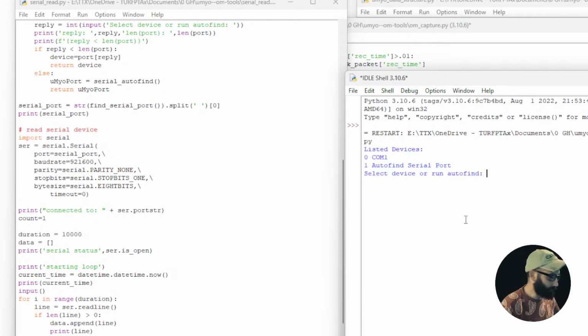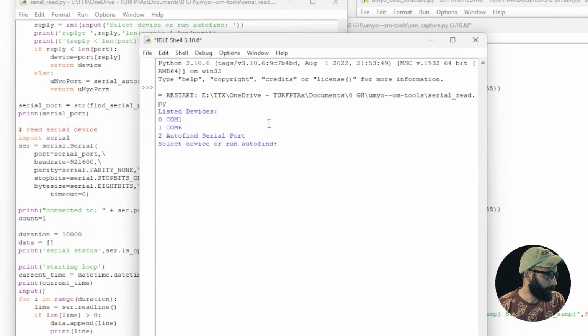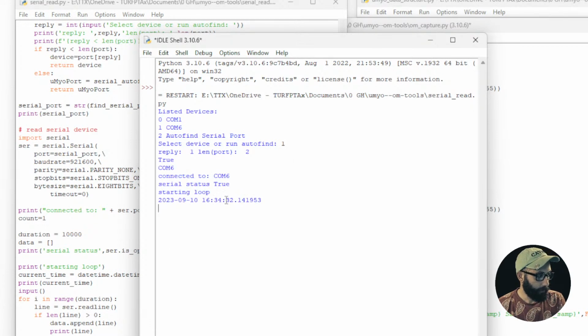I think it's because when I have all the different camera angles together that my computer wants to crash, so I'm going to avoid using that scene. I'm going to turn on one of the devices. I'll have to close this shell. Okay, and I want to run it. So now it's working. So it is in COM6, so we can do 1. And so it should tell us the date time, right? Okay.